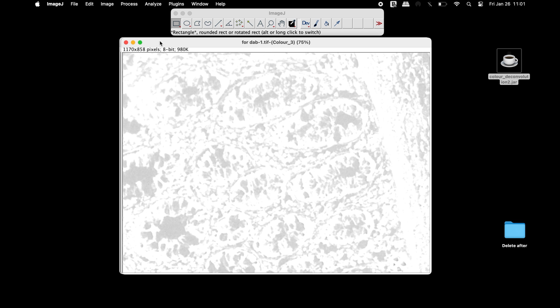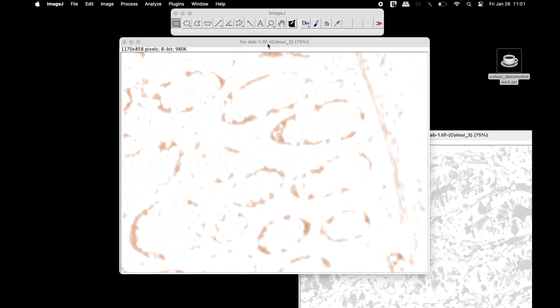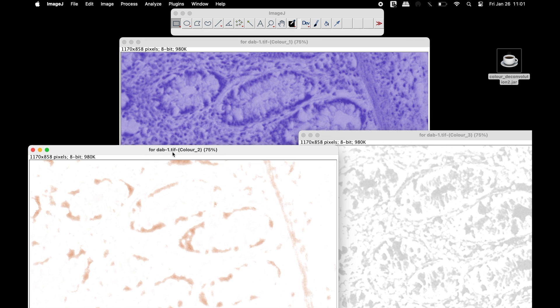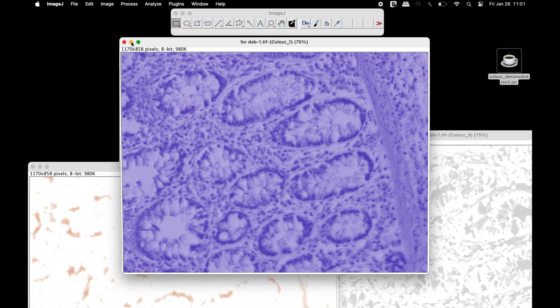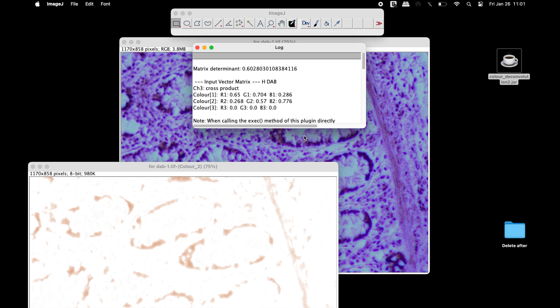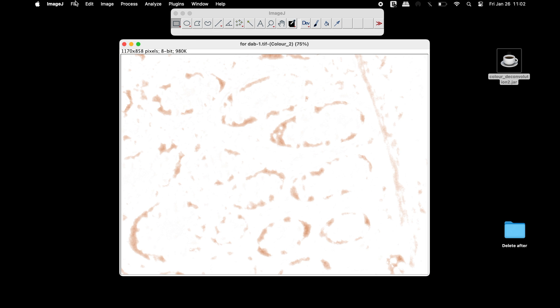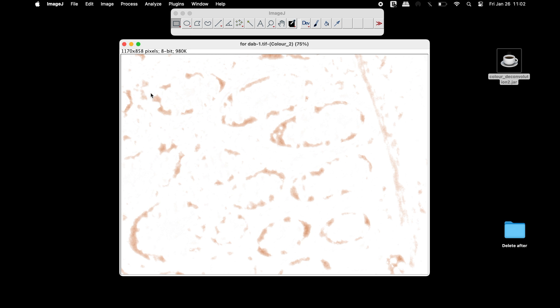At this time, the image is split into three different colors. Retain the DAB and the hematoxylin staining image. In the log window, users can find the vector values for the images. This image can also be saved in any format of your choice.